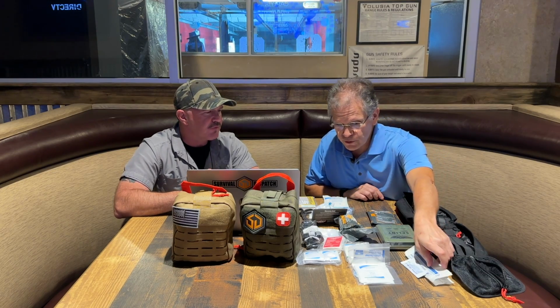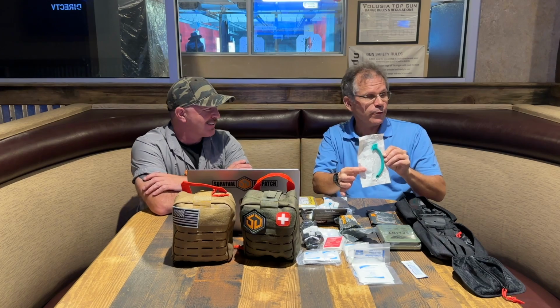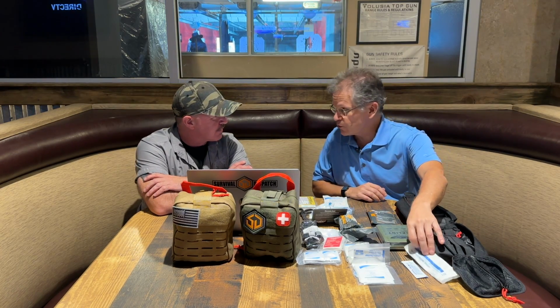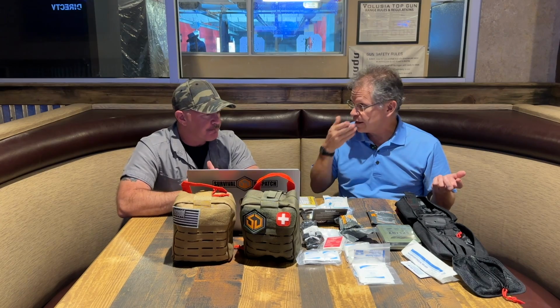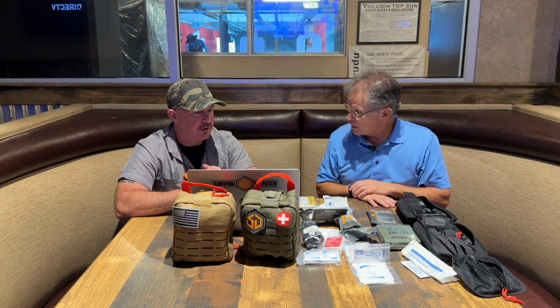The last thing that you noticed that was odd. That's what I was wondering about. Okay, this is a nasopharyngeal airway, and if somebody's got a lot of blood in their mouth or something like that, you put it in the nose and it goes down to the back so that you can breathe through the nose. And it also gives you, if you're doing, for God forbid, CPR on somebody, it allows you to have an airway. A lot of people don't do mouth to mouth anymore, but it gives you an option to get some air in.